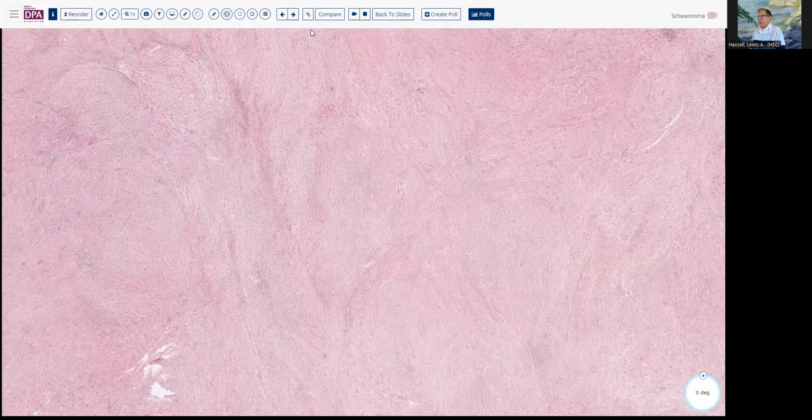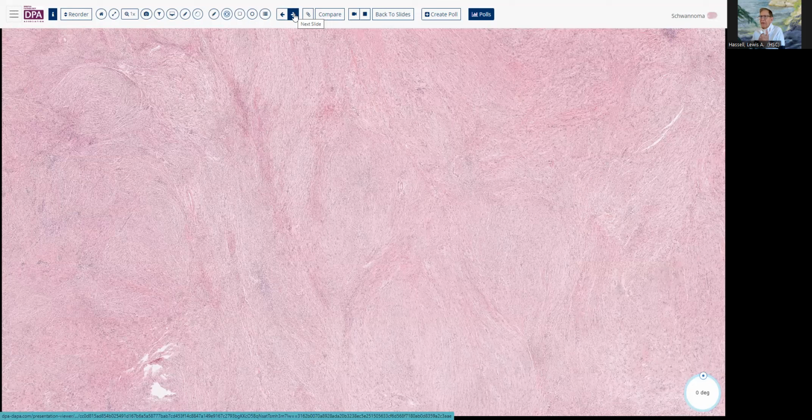Well, your immunohistochemistries, of course, would be confirmatory, but I think the fact that we have the inflammatory infiltrate at the periphery, the cuffing, as well as the mast cells and occasional plasma cells, both point more strongly, along with the nuclear morphology, to a schwannoma.